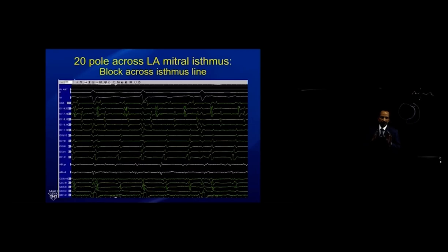First is, in cut and sew maze, the posterior part is usually really an anchor. The second is you cannot trust endocardial activation to be the same as epicardial activation and vice versa. In other words, the CS ceases to be a surrogate for endocardial activation, and an endocardial map does not tell you whether there is the same activation epicardially.